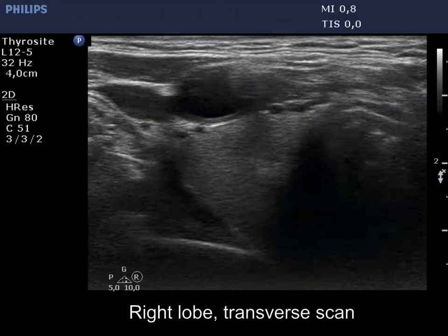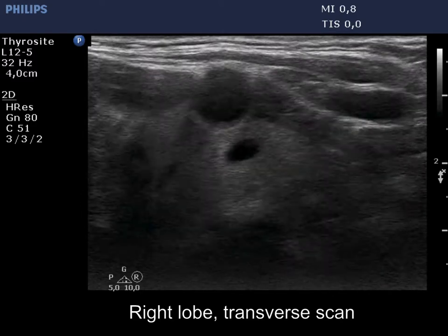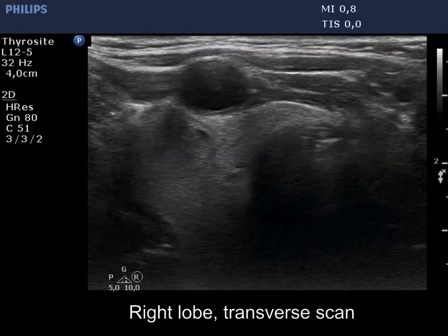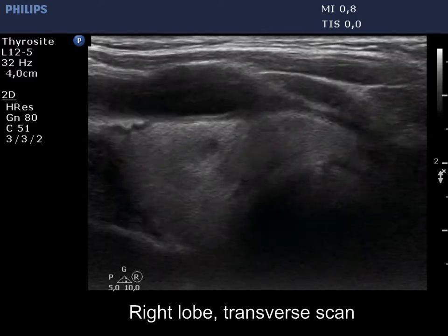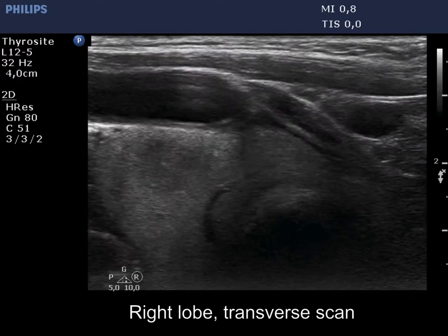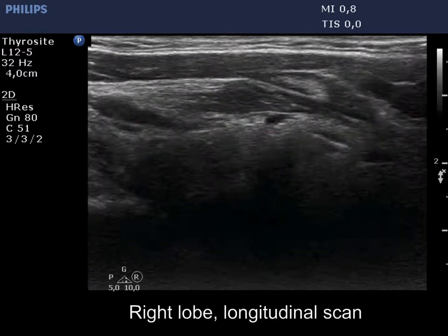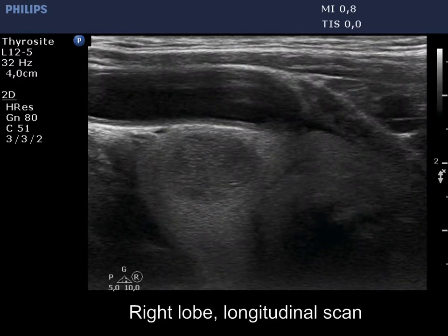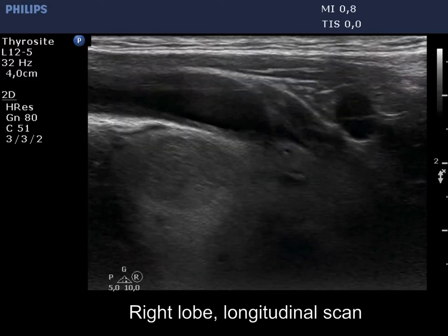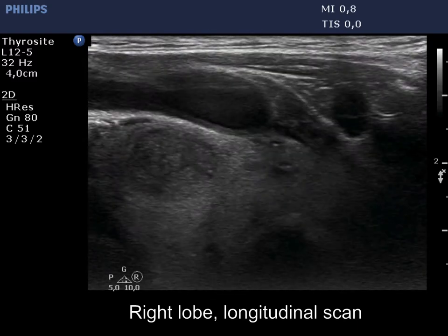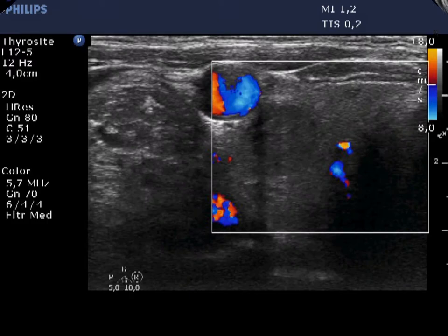There is a hypochoid nodule in the ventral lateral part of the right lobe. Note the unusual location of the carotid artery, which in this patient runs not lateral but ventral to the right lobe. The nodule presents echogenic lines and granules which correspond to connective tissue. The lesion is avascular.